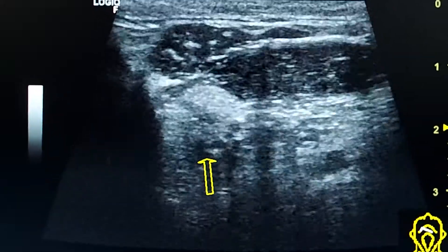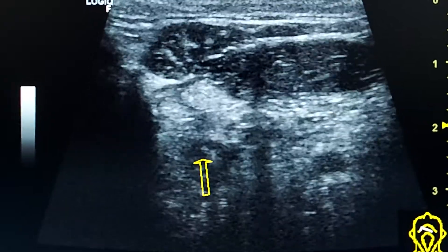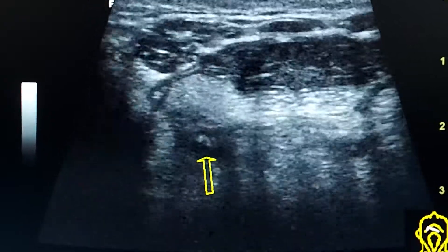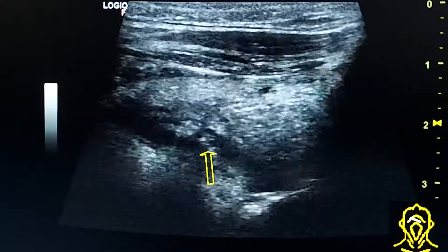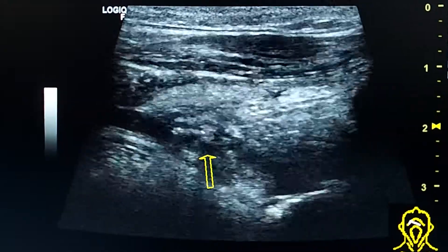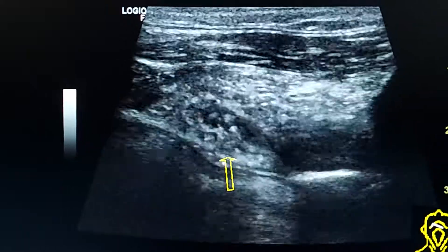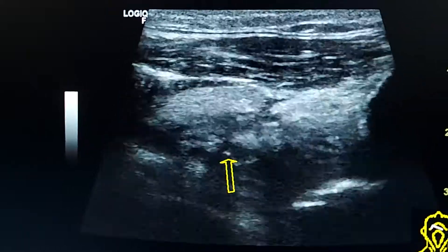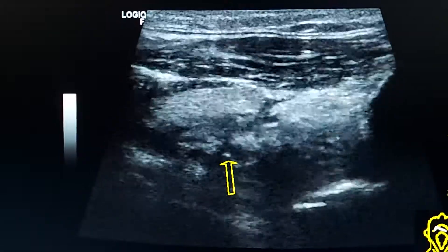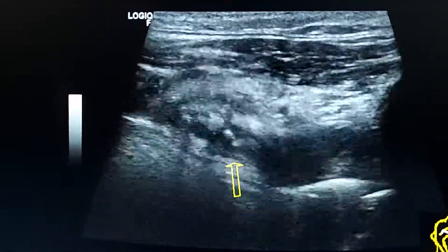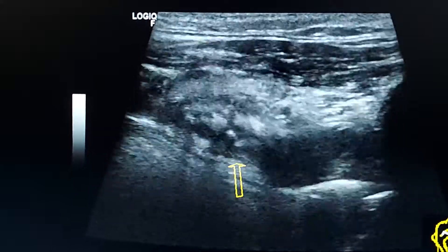We also see thickening of the epithelium of the secretory duct and echogenic fat around it. Here is the longitudinal section, and the patient is moving his tongue — we see movement of the duct and the stone.